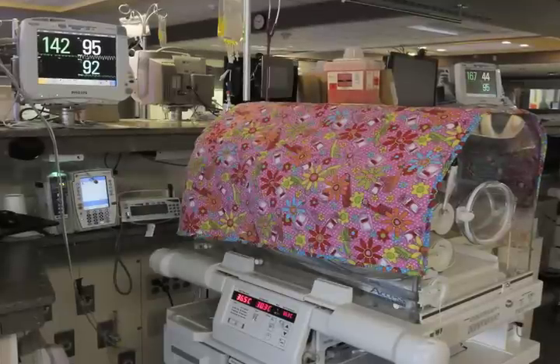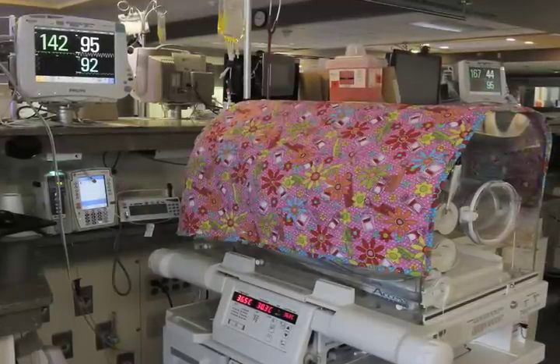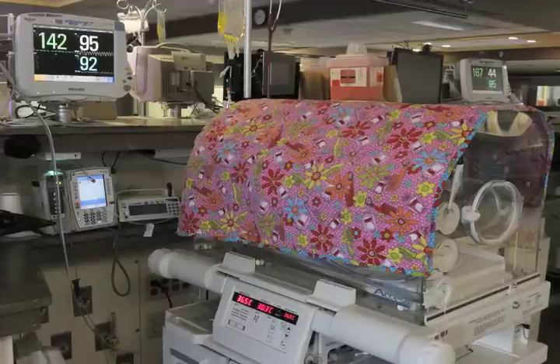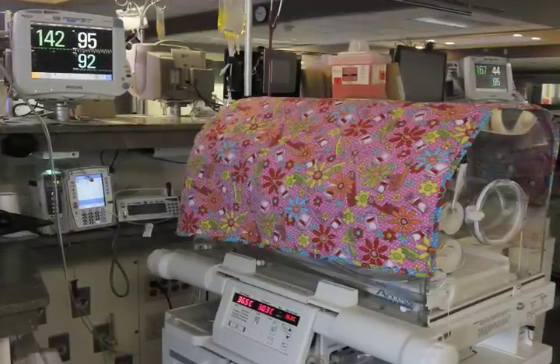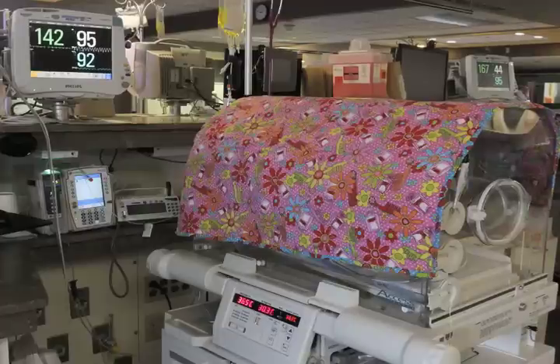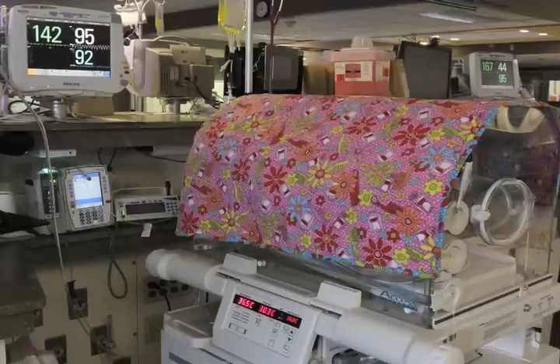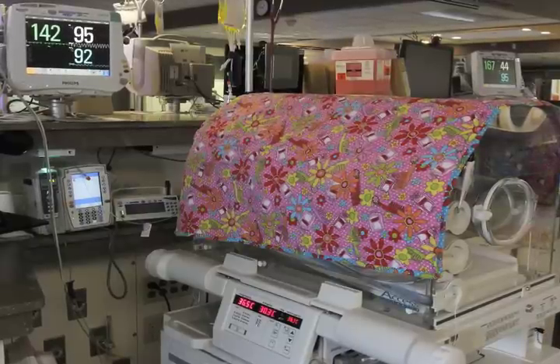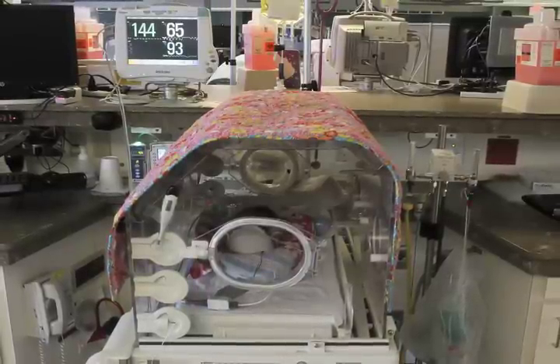Once a baby is stable, they will be placed into an isolette. An isolette is designed to help regulate the baby's body temperature and provide a quiet environment that promotes growth and development. A blanket or quilt is placed over the top of the isolette to muffle sounds and block light, also creating a supportive environment for growth and development. Portholes on the sides of the isolette can be opened, providing access for the baby during medical care or parenting, while keeping the baby warm inside of the isolette.